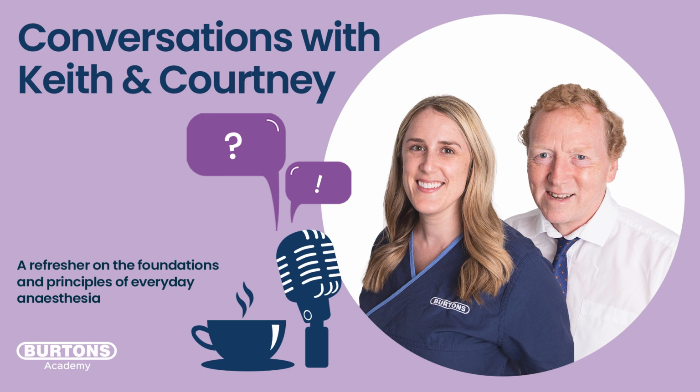Or in horses, I'll stick it up their nose and have a bit of sponge that just goes up the nose and pushes. I say sponge, it's like a foam. You just compress the foam, push it up behind the pulse ox that you put against the nasal septum, and then just let it go. And it just holds the reflectance probe against the nasal septum. Get lovely traces in horses doing that, which doesn't deteriorate over time. That's a nice thing.